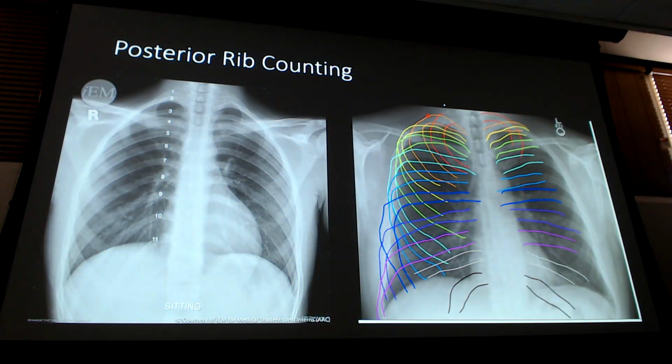And so I go, okay, where's my first one? Oh, here's my first steep anterior rib. Here's number 2. I'm going to trace number 2 up, and boom, it's right there. So that's 2, and I count down. If you want to go even further, you can go 1, 2. Here's number 3 back in here. If I follow that up and curve it, it curves right into number 3. You see what I'm tracing? Let me do it on this side.